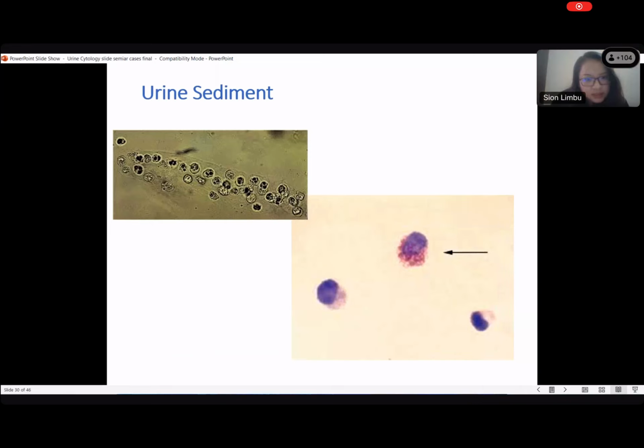So urine shows WBC, white blood cell casts. We can see the neutrophils and probably some eosinophils as well. So the second picture shows eosinophils. We can see the orangeophilic granules. So which stain can you do in urine to detect eosinophils? Is there a specific stain you are aware of where we can detect eosinophils well in a urinary sediment? Because the routine stains won't work here.